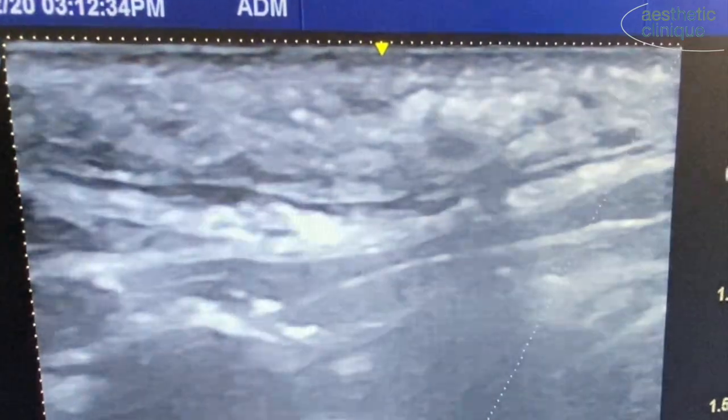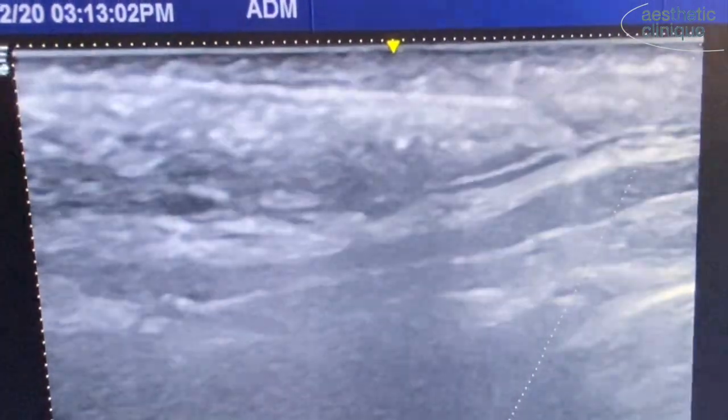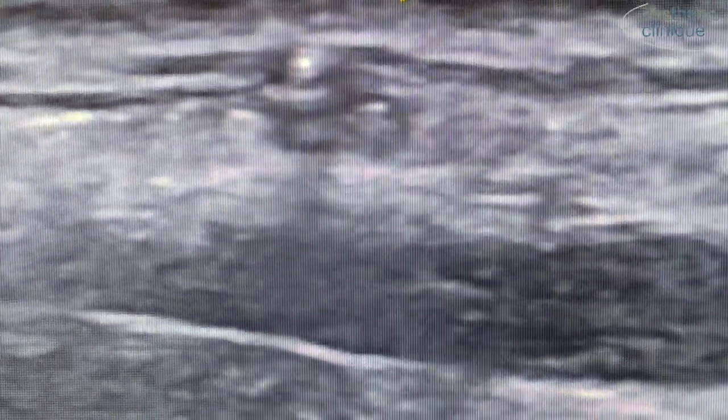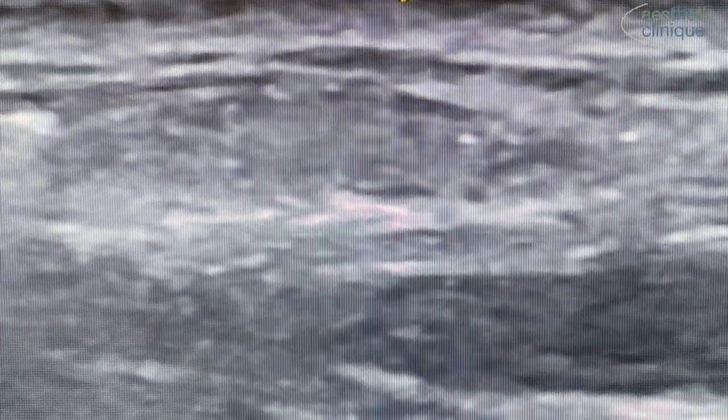So it's between the platysma and the deep dermis, and it's a retrograde technique. What you will notice are small, microscopic, hyperechoic — which means white — spheres within the Radiesse. This is the calcium hydroxyapatite microspheres.